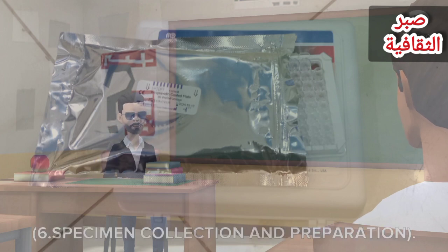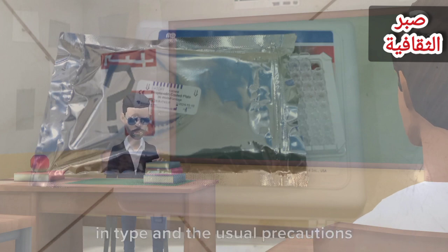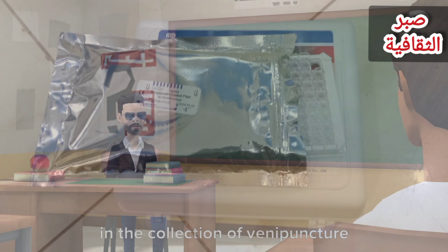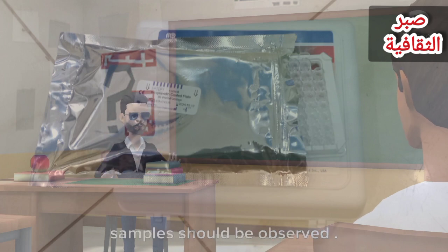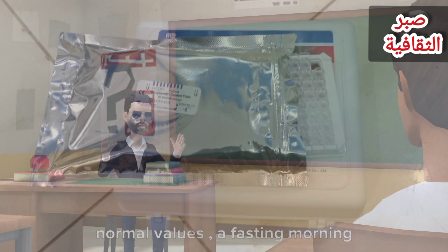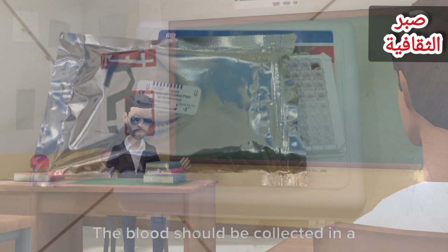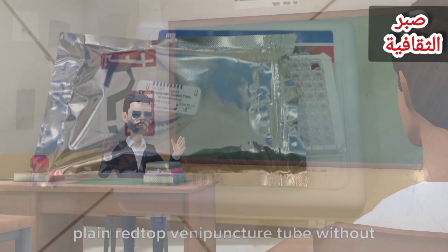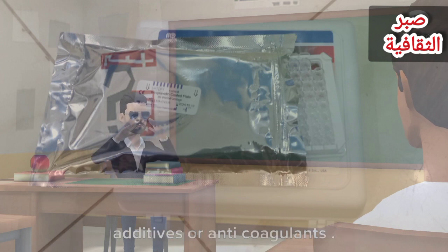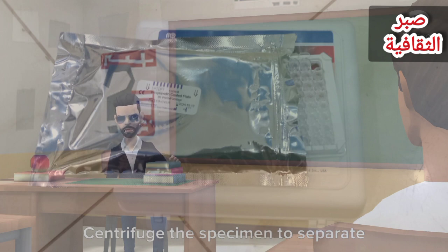6. Specimen collection and preparation. The specimen shall be blood, serum in type, and the usual precautions in the collection of venipuncture samples should be observed. For accurate comparison to established normal values, a fasting morning serum sample should be obtained. The blood should be collected in a plain red-top venipuncture tube without additives or anticoagulants. Allow the blood to clot.